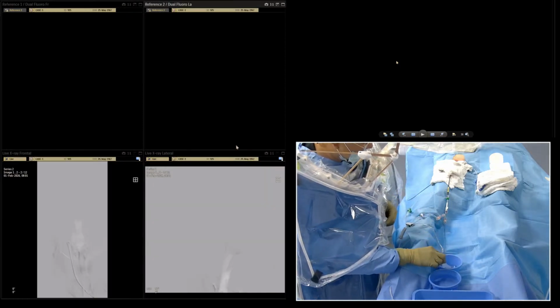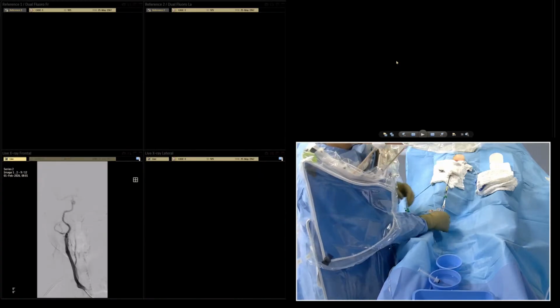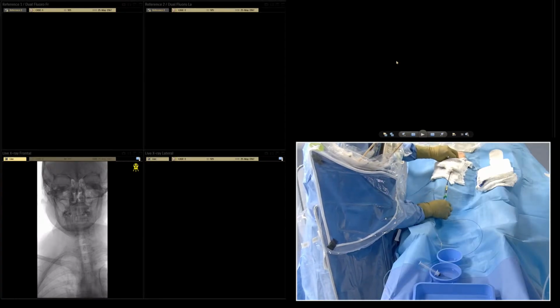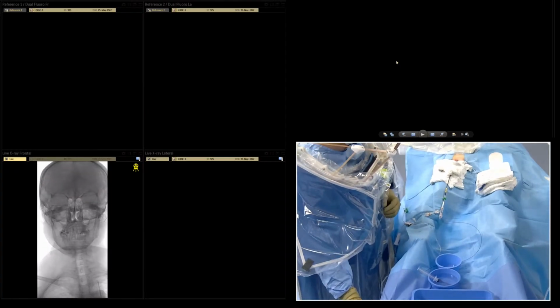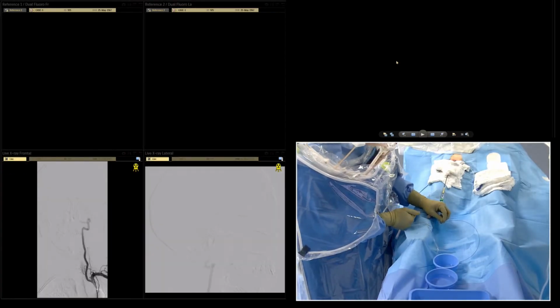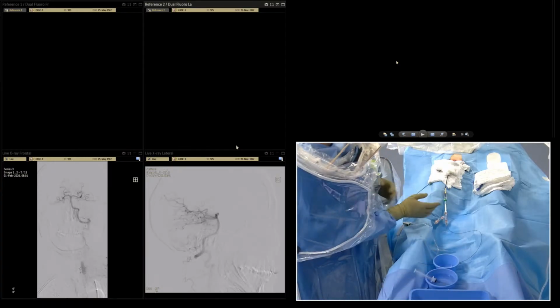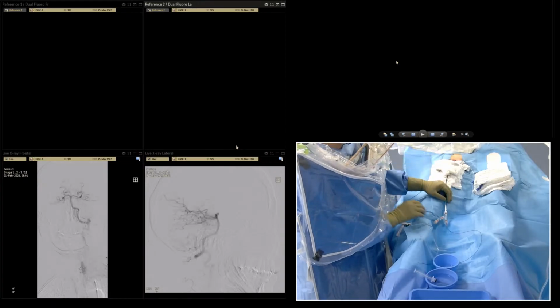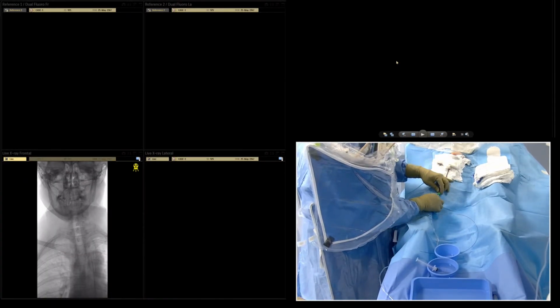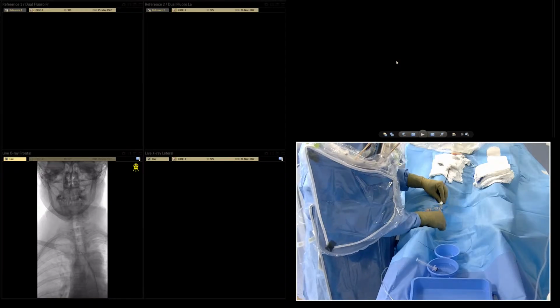The guiding catheter is Judkins Right 6 French Klimber from Terumo company, and it's inside the 6 French guiding sheath, which is 90 centimeter, guiding catheter, 90 centimeter, and 8 French sheaths for the more comfortable navigation, which is Prelude from Merit Medical Company. We usually use this setup.